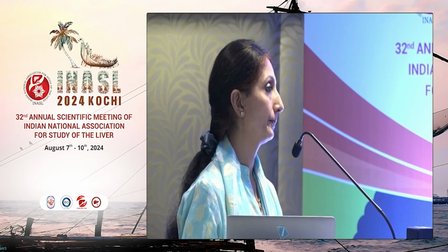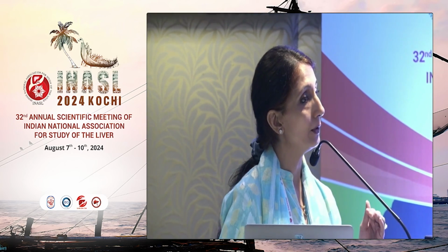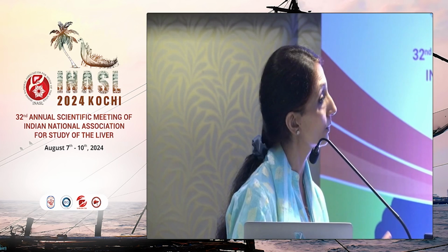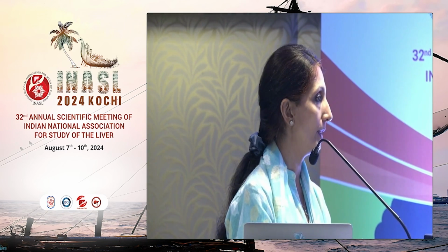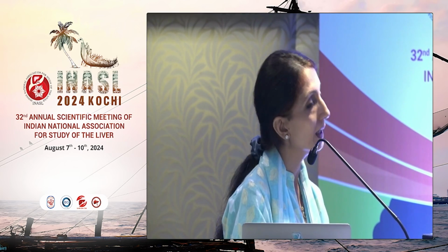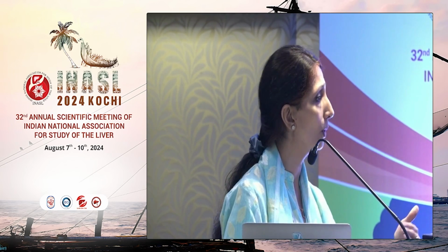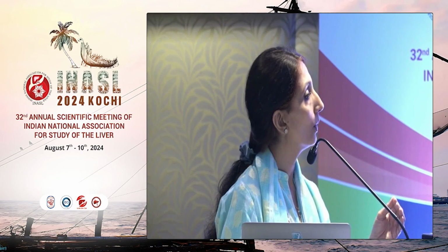So would you use it in practice, let's say if you don't want to spend money on contrast? I would spend it on diagnosis, especially in cases where there are children or patients with renal issues, which we get a lot in liver patients. The niche for contrast ultrasound with liver patients is that they have both kidney and liver disease and they don't want to get a CT done. That is where this modality is just excellent. Or for children, where it's not documented, but let's say 18 to 22, or those on follow-ups for other lesions, or EHPVO or other such things.